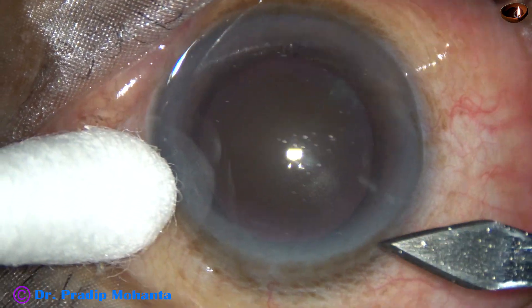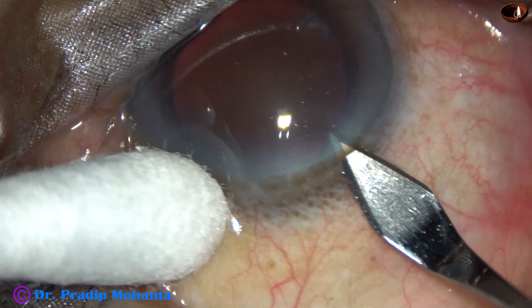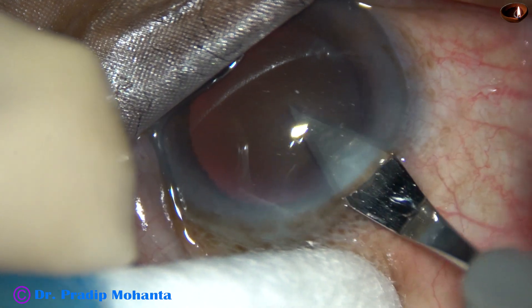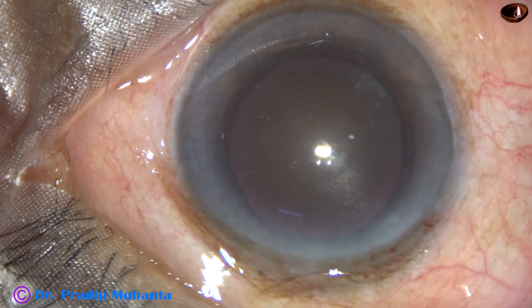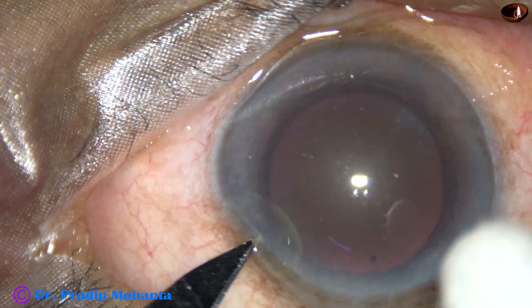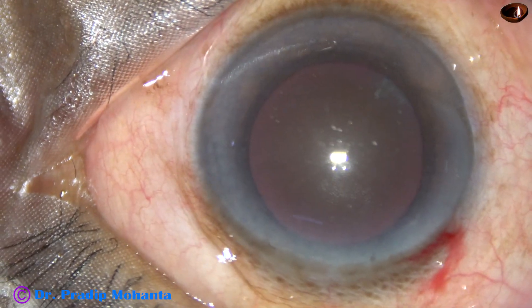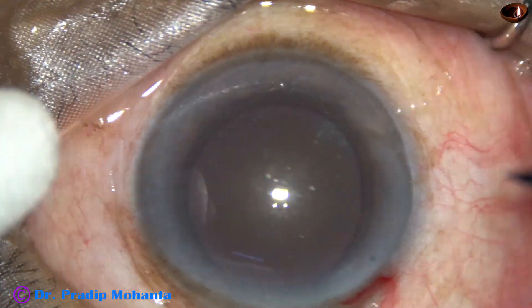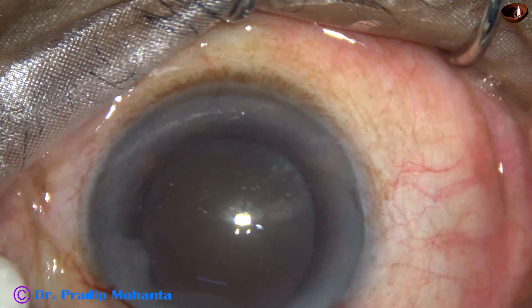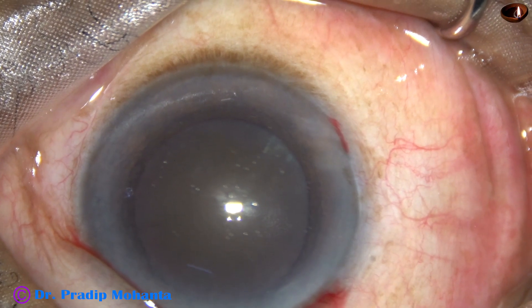This is the main incision on the posterior aspect of the limbus with a 2.8 mm steel keratome. Now this is a side port on the left side of the main incision, and this is another side port on the right side of the main incision. The patient is under peribulbar anesthesia.